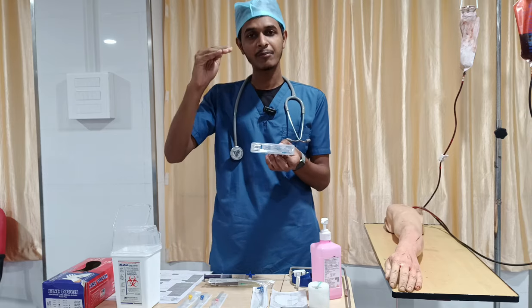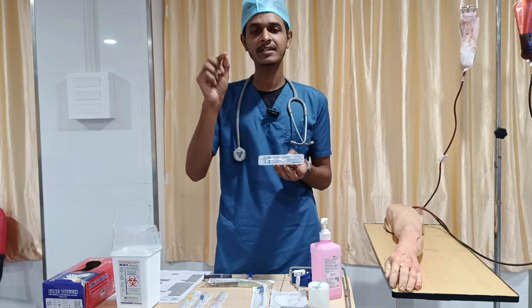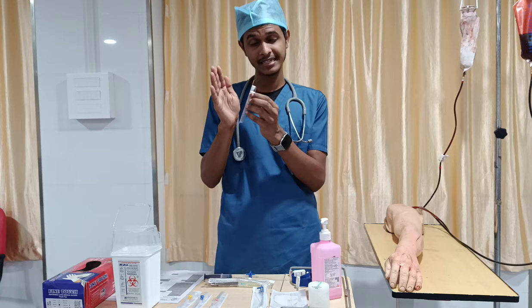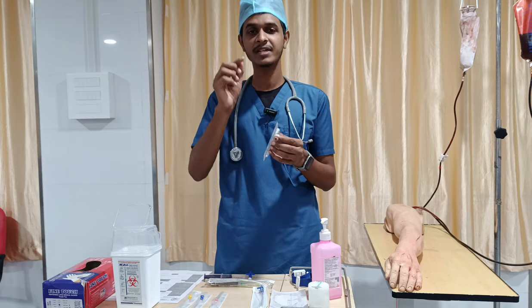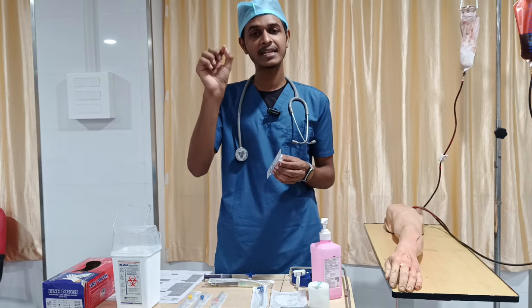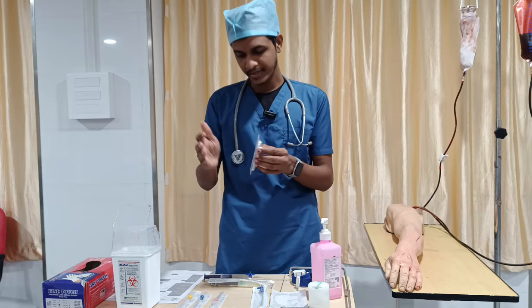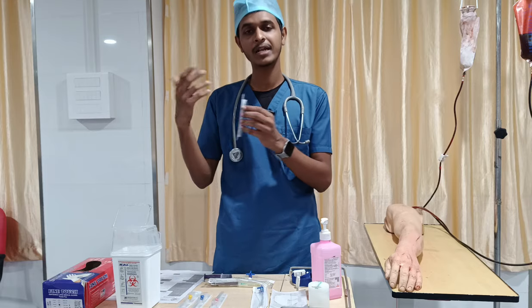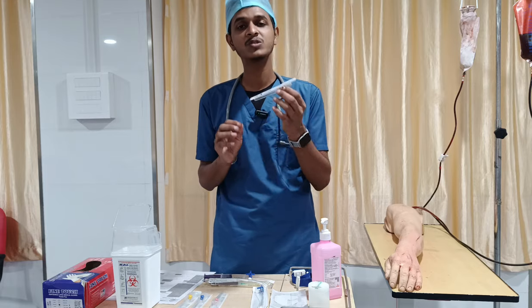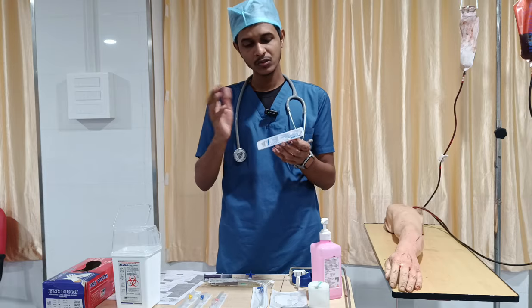So if the number is small, like 14, the diameter and the length of the catheter will be on the higher side. But if you go to 24 or 26, the length and the diameter of the catheter will be reduced. So if you want to do a PRBC or some blood product transfusion, ideally you have to choose a larger size of cannula. Okay, so that is one thing.